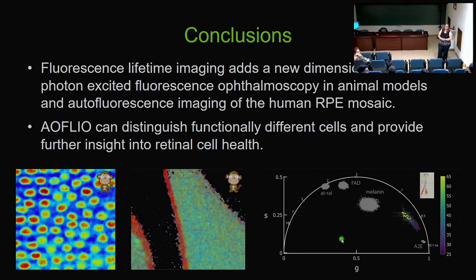It was a great talk, and I'm really curious, there's so much information you have to get with multiple fluorophores in the eye, and having the lifetimes change so much with being bound, being free, maybe if there's a different concentration of things in there. I'm curious if the concentrations are important. It's a two-part question, I guess. If the concentrations are important for what you're looking at, pixel by pixel or on average, and do you use any sort of maximum likelihood or least squares to deconvolve what the different concentrations are doing in the image?